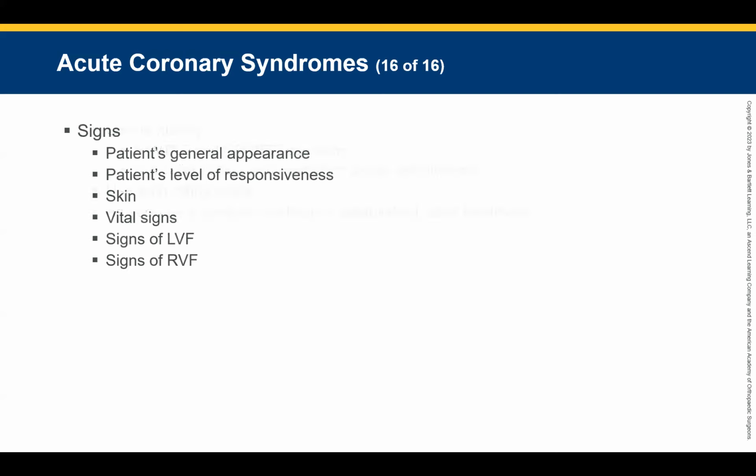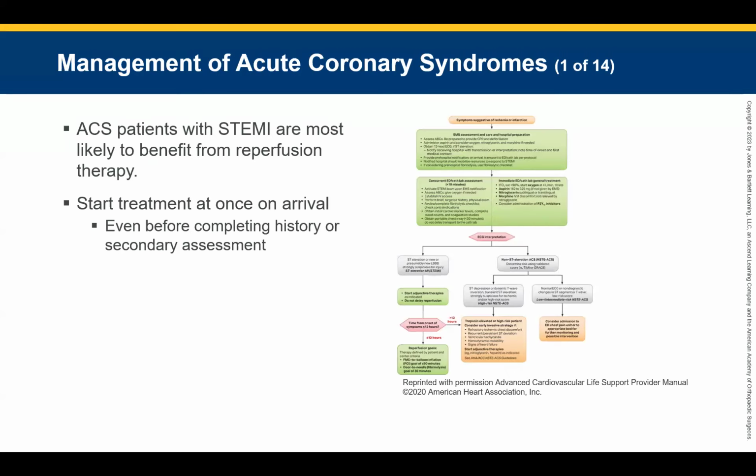We're putting all that information together to figure out what we got. Okay. Treat your patient, not the monitor. Treat your patient, not the monitor. The monitor can look really bad, and your patient can be fine. The monitor can look fine, and the patient can look really bad. Treat the patient, not necessarily the monitor.